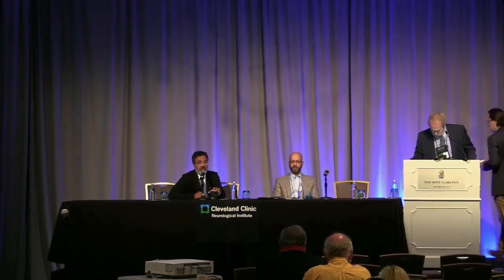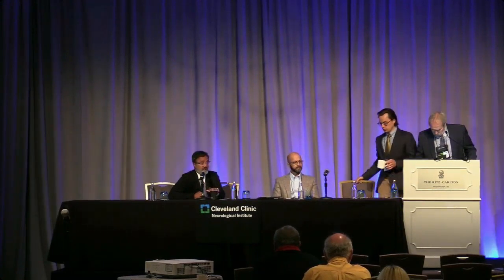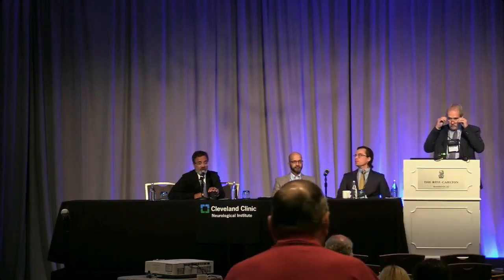So the question was, what do you use to consider the treatment of PLEDs, and how aggressively should you treat them? That's a very controversial question in the past. At this present time, first of all, those patients should be watched very closely on continuous EEG. Those patients should be treated adequately with anti-seizure medications. How aggressively you treat them is a little bit variable from person to person, depending upon the clinical situation at hand. Typically, these patients require multiple anti-seizure medications.